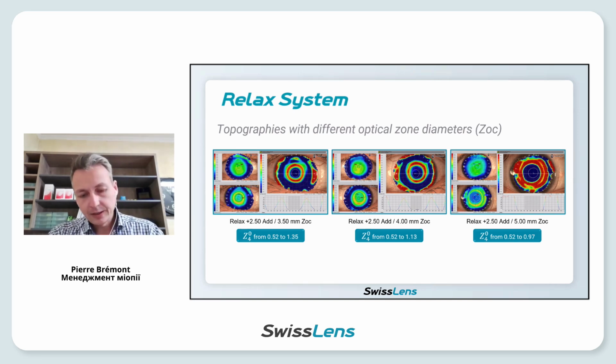A standard eye is around 0.5 in spherical aberration, between 0.4 and 0.5. Almost the whole population is around this spherical aberration. With the smaller central optical zone, we can have a higher spherical aberration than all the others.